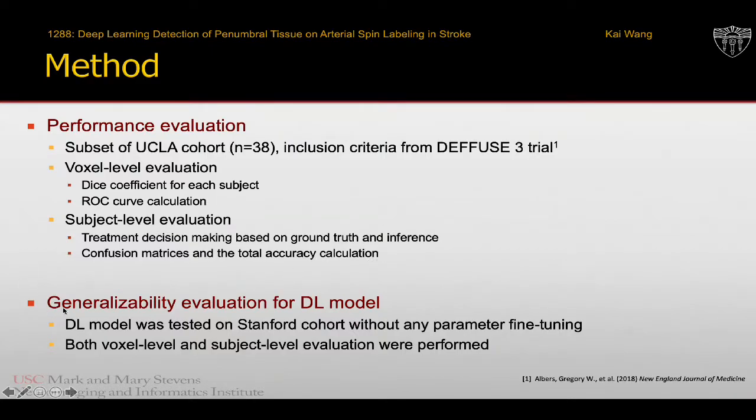To evaluate the generalizability of our deep learning model, it was tested on the Stanford cohort, which came from a different site and a different platform, without any parameter fine-tuning. Then both the voxel level and subject level evaluations were performed.